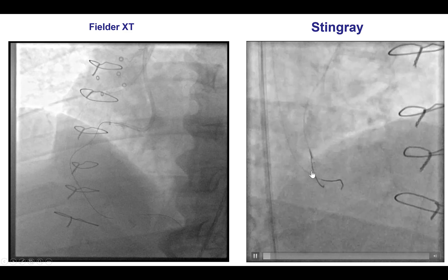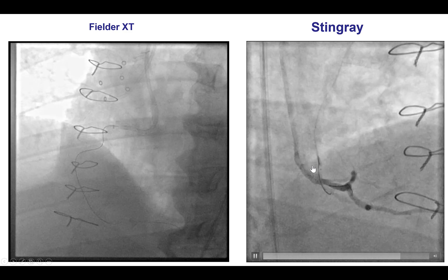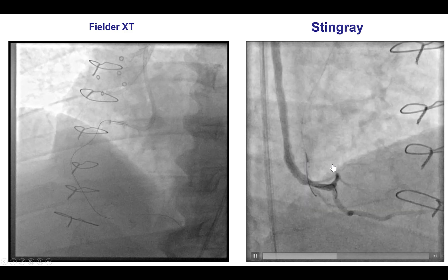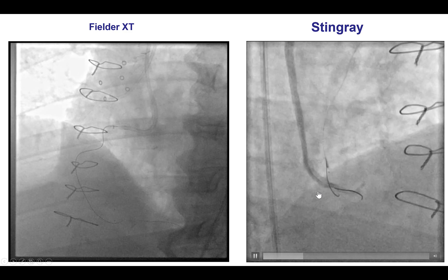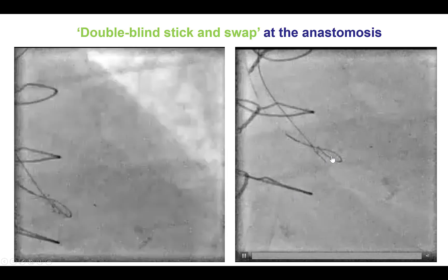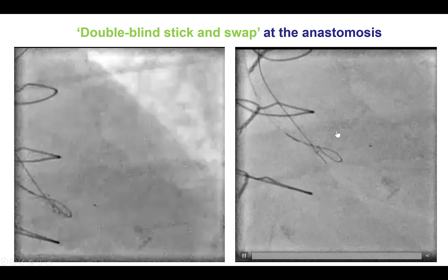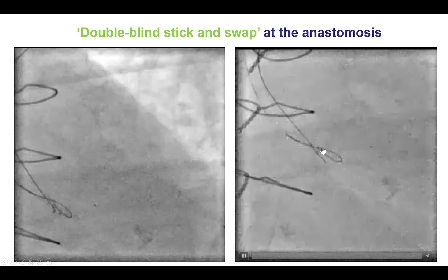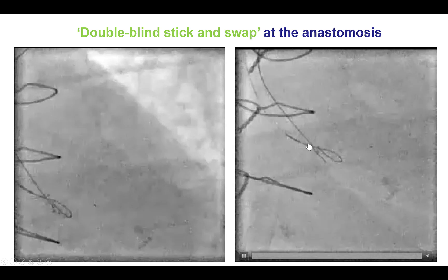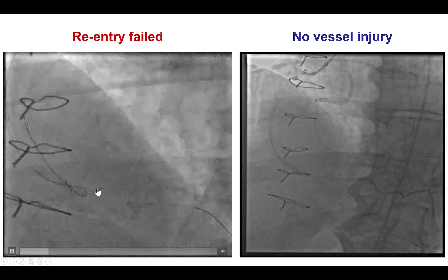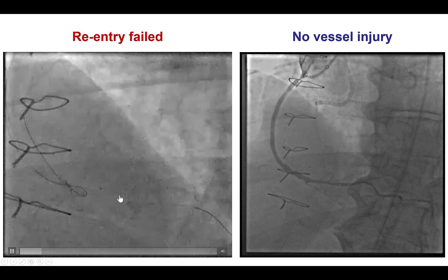The initial re-entry was proximal to the touchdown of the saphenous vein graft. We can see the two markers of the Stingray balloon with the guide wire exiting proximal to the proximal marker; however, re-entry attempts there were not successful. We advanced the knuckle further down, literally at the touchdown of the SVG, and repeated re-entry attempts using the double-blind stick-and-swap technique, using the wire seated in the vein graft as a marker of where the true lumen would be. Unfortunately, despite those attempts, it was not possible to re-enter into the distal true lumen.